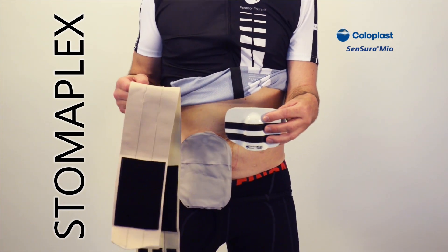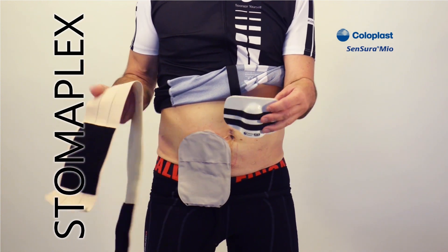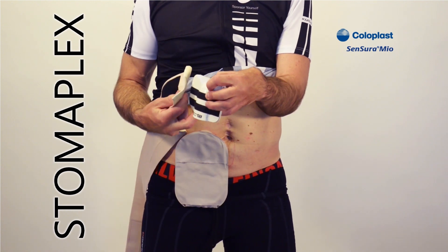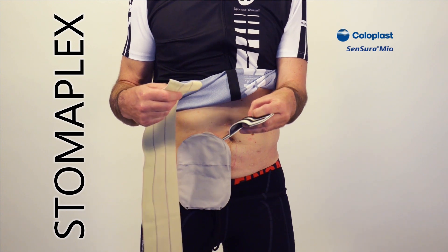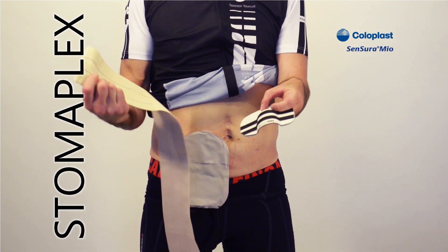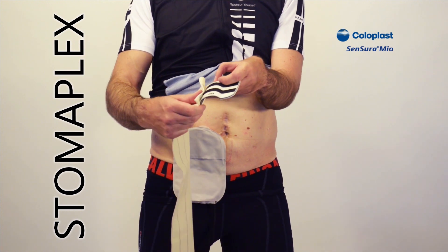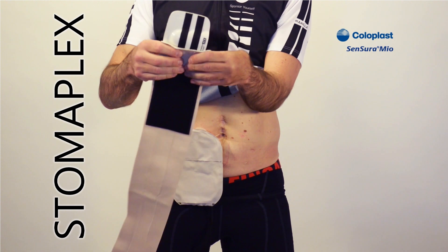Now I'm going to show you how easy it is to wear the Ostomy Belt and Stoma Guard from Stomaplex. This is the extra duty belt. This one will help hold your abdomen tighter and prevent any hernias from forming, which may happen during sporting or strenuous activities. Just like the standard belt, this one attaches to the face of the guard by rubbing it onto those Velcro strips like that.